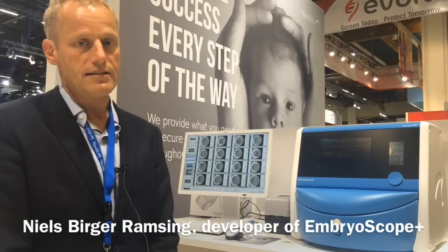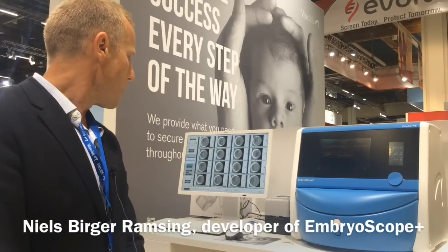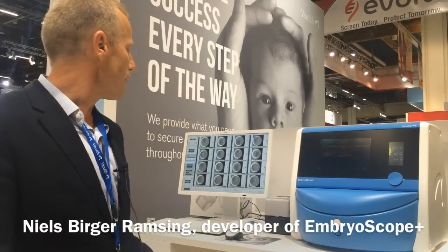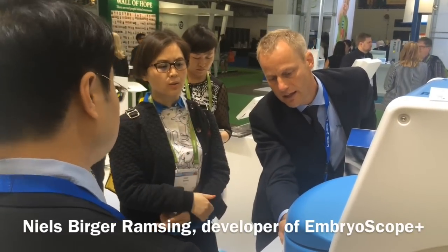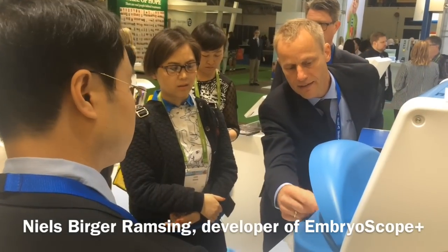It's compatible with all other utensils used for the EmbryoScope. We hope you'll come and see it — we have new dishes as well, and a lot to show you about the software and the daily handling of this instrument, which we think is quite improved compared to the original EmbryoScope.